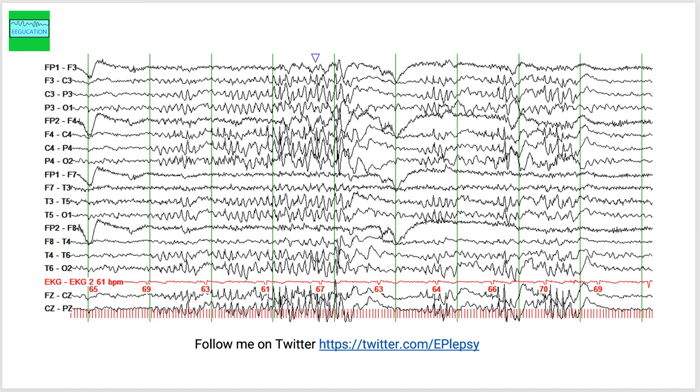This is the same page at lower gain. So you're able to appreciate some of the spikes that are in the background.